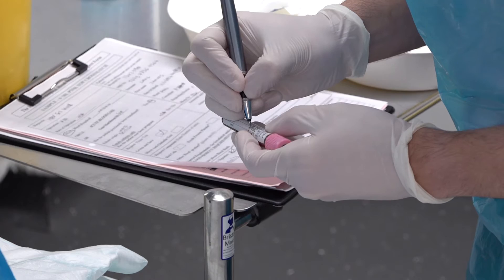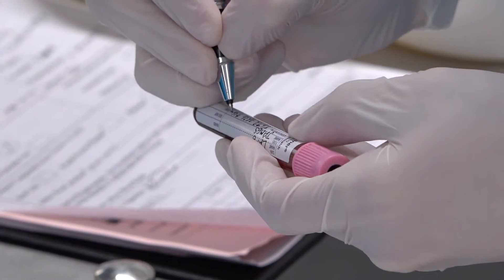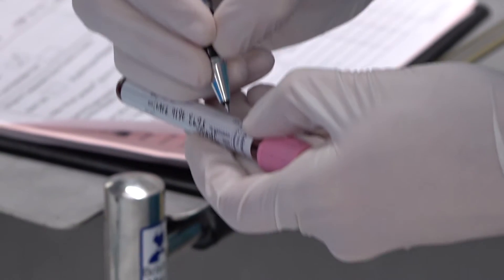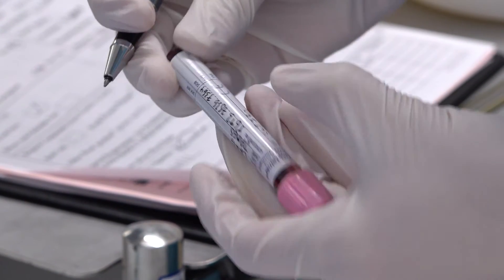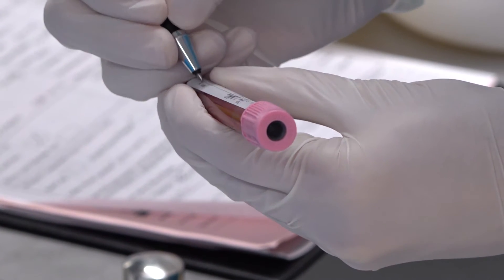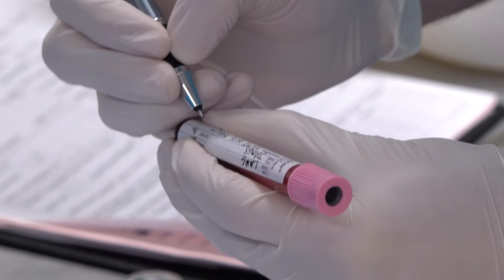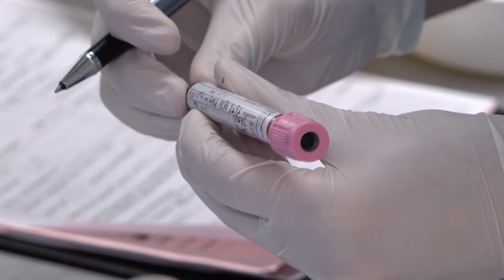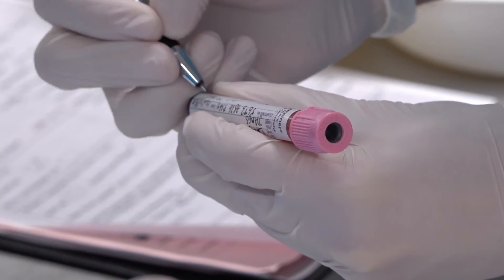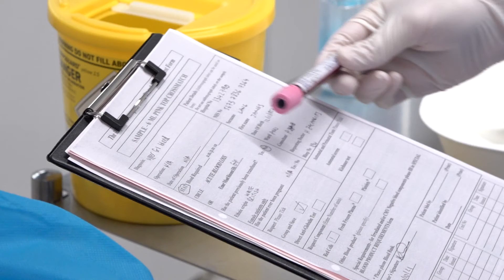Immediately after taking the sample, clearly write the patient's details on the sample bottle. We recommend using block capitals and black pen that will not smudge. You must do this at the patient's bedside. This should include their full name, their date of birth, their hospital number, and the date and time of the sample with your signature. Most trusts require this bottle to be handwritten. Some trusts allow the use of printed labels — please check local guidelines. When using labels, remember to check the information on the label against the request form and the patient's ID band to ensure it is correct. The transfusion laboratory may reject the sample if it has been inadequately labelled.